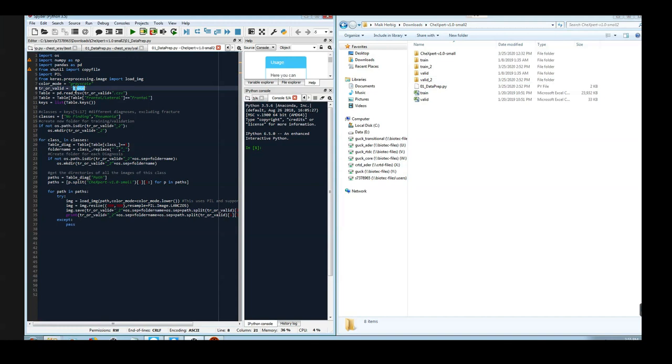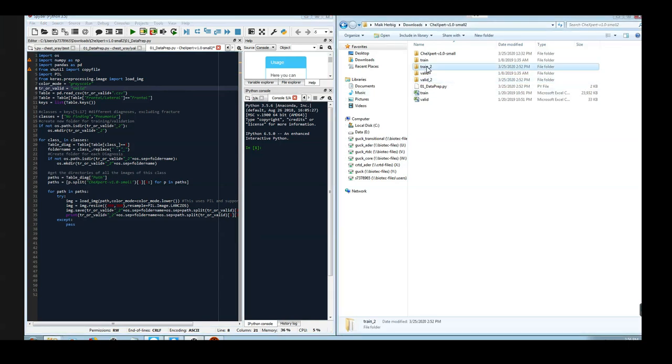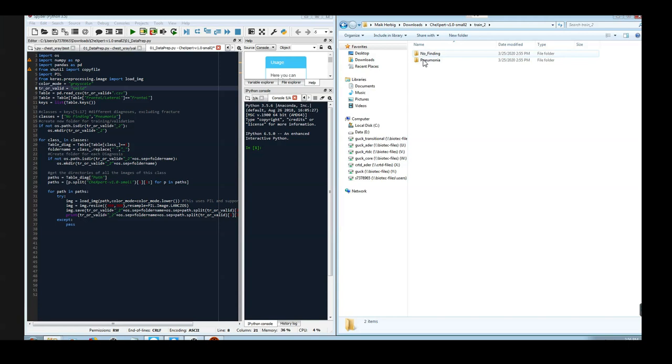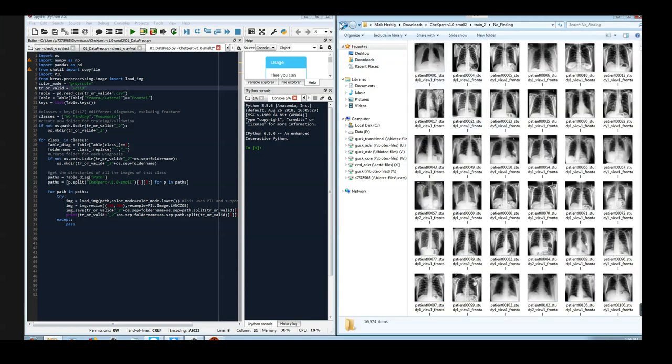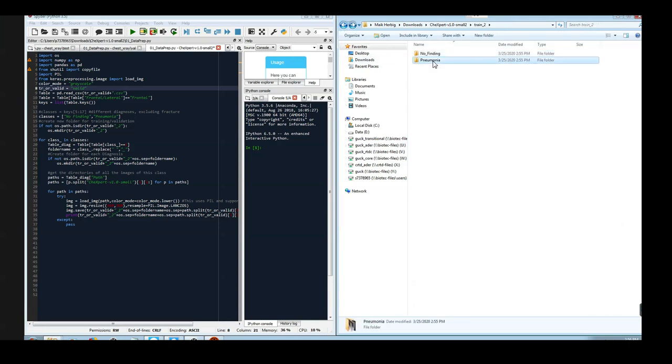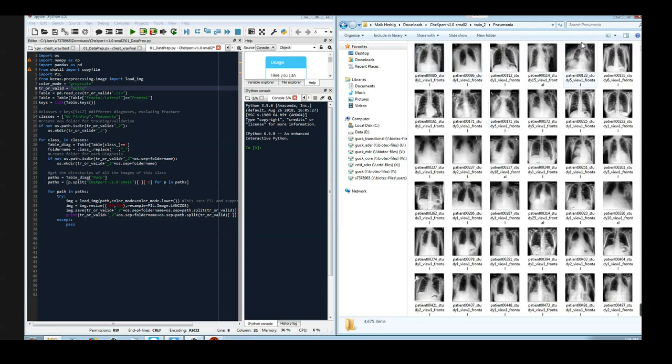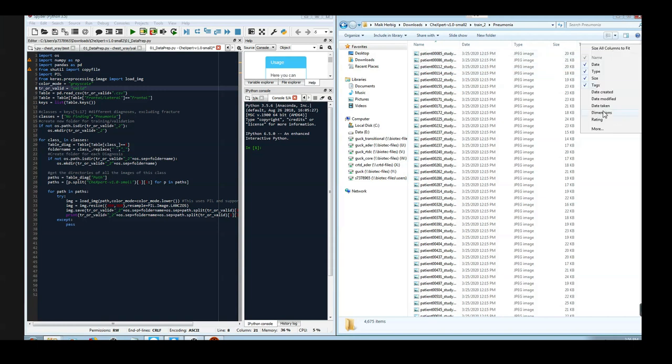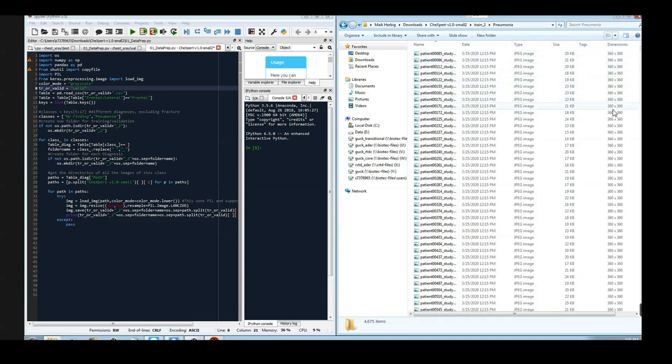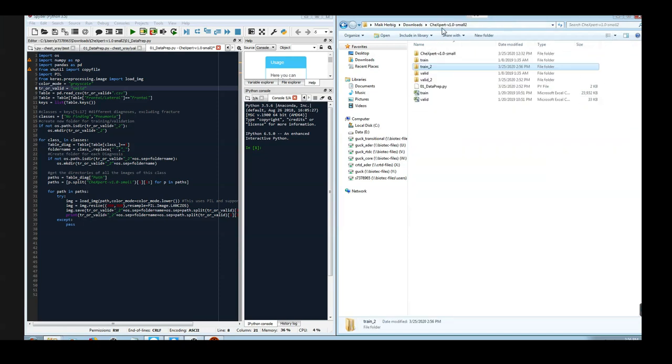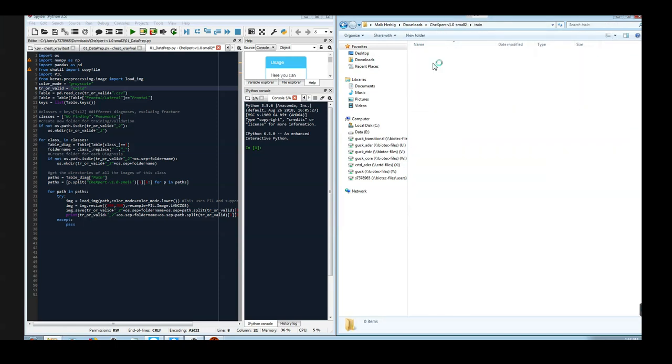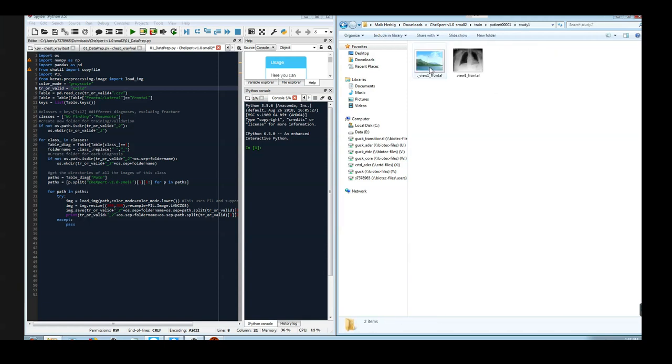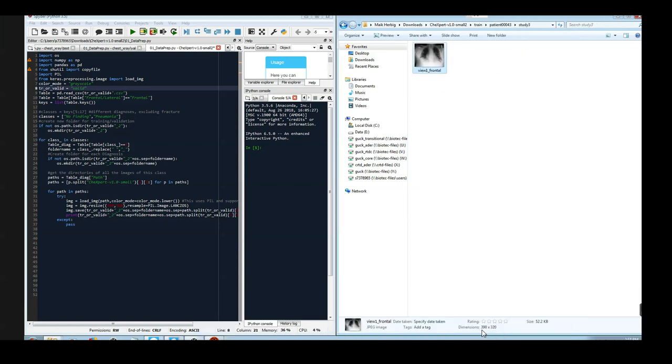After you run this script once for training and once for validation, you will get new folders called train_2 and valid_2. And when you have a look into these folders, you will find that there is now a folder for 'no finding' containing images and another folder for pneumonia containing images. Let's have a look at the details of those images in order to check the dimensions. Now all the images are 360 by 360 pixels, while the initial data actually contained images of very different dimensions. For example, this one has a dimension of 389 by 320. This one has 390 by 320.